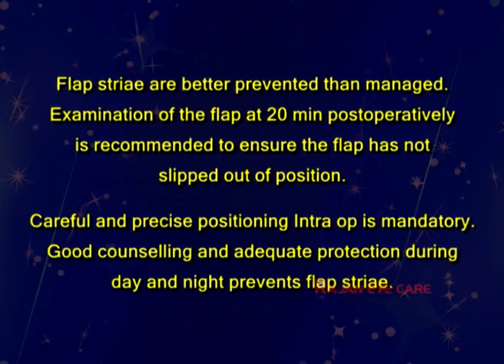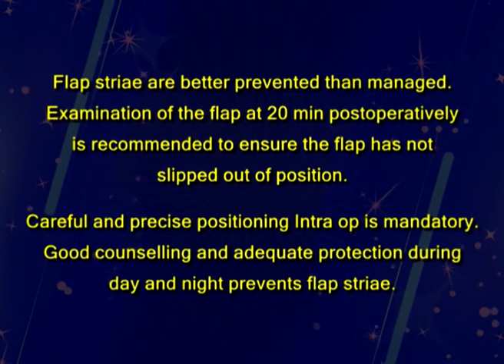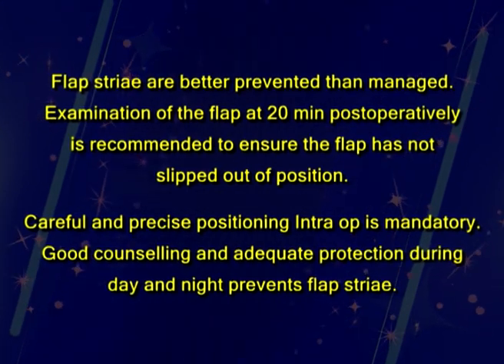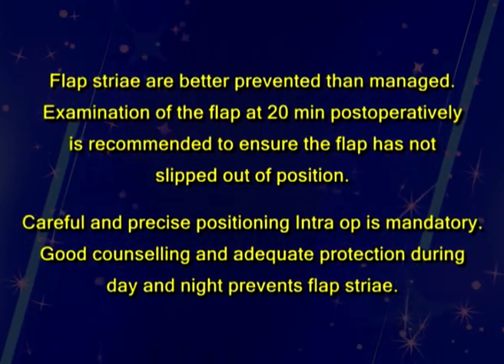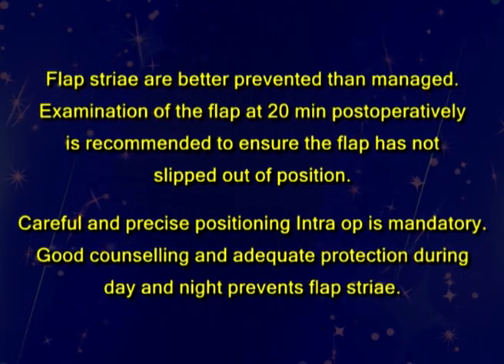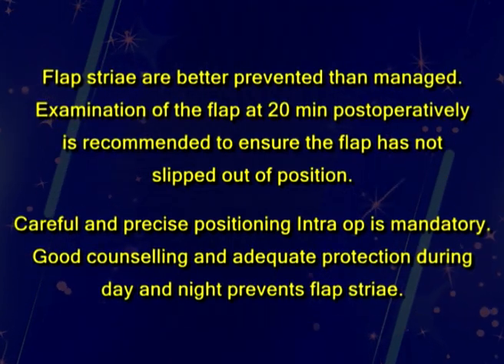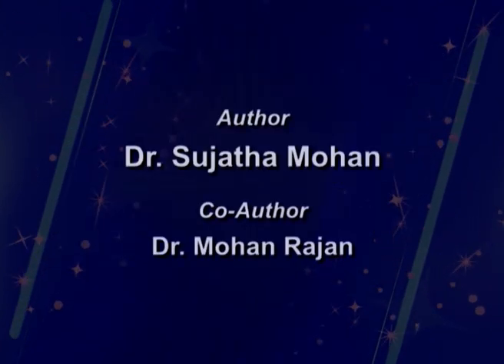Examination of the flap at 20 minutes post-operatively is recommended to ensure the flap has not slipped out of position. Careful and precise positioning intra-op is mandatory. Good counseling and the need for adequate protection during day and night prevents and lowers the incidence of flap striae.